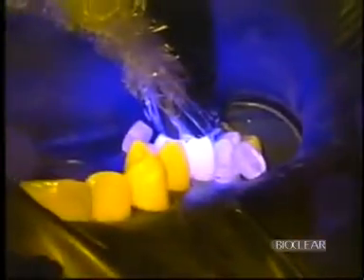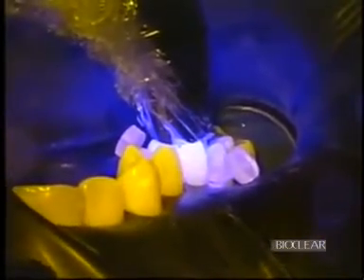For total etch techniques such as I'm incorporating today, I'll go ahead and place a second layer of bonding resin over the dentin to get a superior dentin bond and to reduce potential post-operative sensitivity. We'll air thin again and then cure a second time.